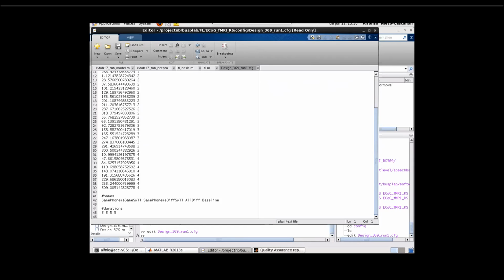If Jen set up the experiment, there's usually a line of code that waits for the first scan, and that gives you a reference time to calculate the rest. That would be the trigger, right? That would be the trigger. Yeah, because it is checking for the trigger.